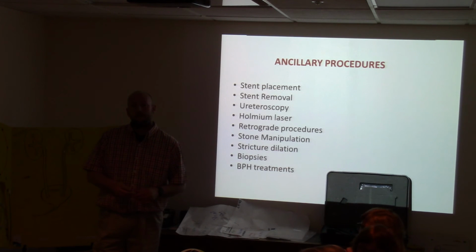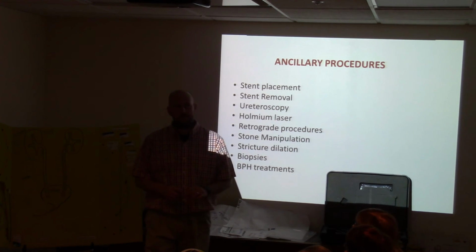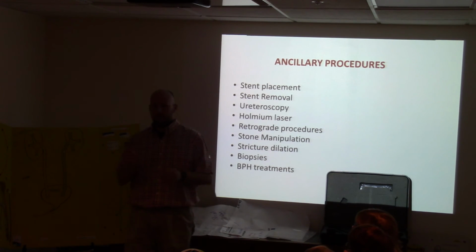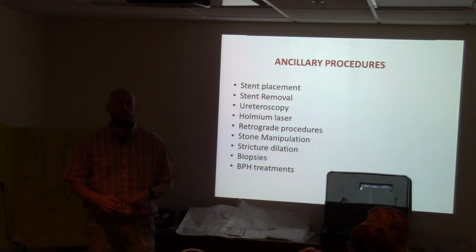How often does that happen, like if they perforate? It could happen quite a bit. Actually, almost every ureteroscopy has some type of perforation of the ureter. It could be just a wire poking through, because you always have to have access to the kidney, so you always have to have a wire in for a ureteroscopy. As an X-ray tech, you'll see the wire go like this. You're like, oops, there goes one. And it's just a little pinhole, and it heals itself.